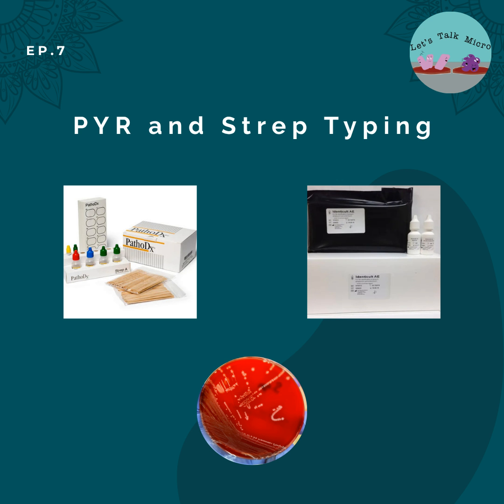So for the intents and purposes of this flow chart, let's just stick to the PYR on the strep. There are some cases where you can do a PYR for a staph, but let's not go there right now. Let's just stick to the strep. So you have a gram-positive cocci in chains. Your catalase is negative. You do your PYR, and then it's positive. So you can have either Streptococcus pyogenes or Enterococcus.